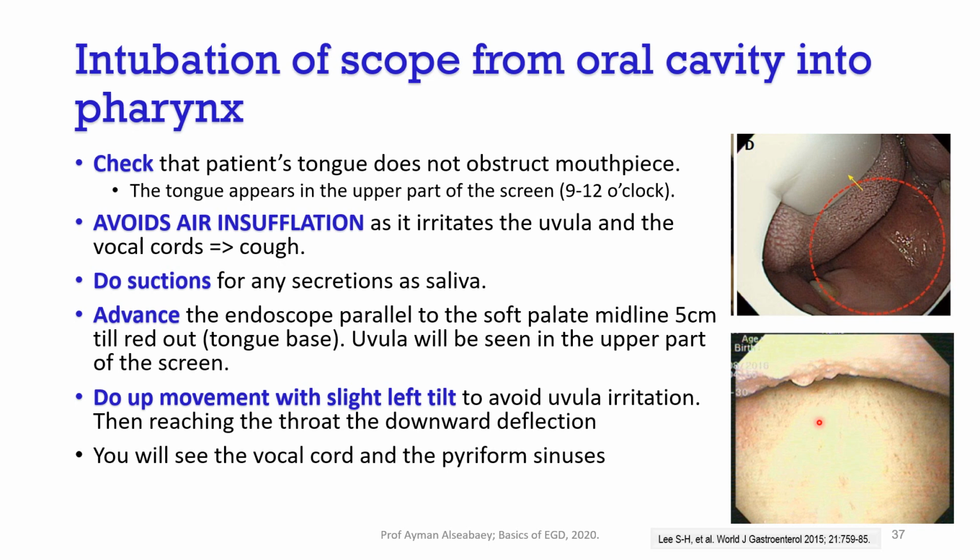Don't touch the uvula, because if you touch the uvula, gag reflex will occur. Never, never, never use injection of air or water in the mouth or the hypopharynx, because it will cause aspiration and it will cause gagging. So don't put your middle finger over the air water button. Remove it. We don't want cough or gag.